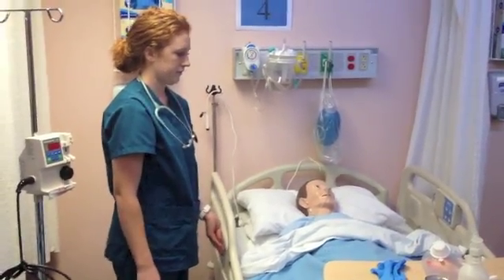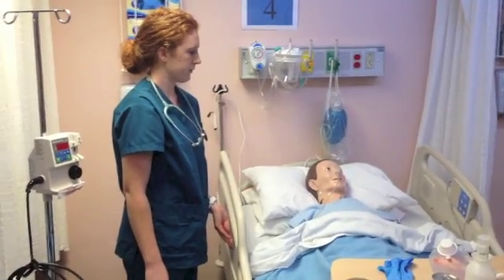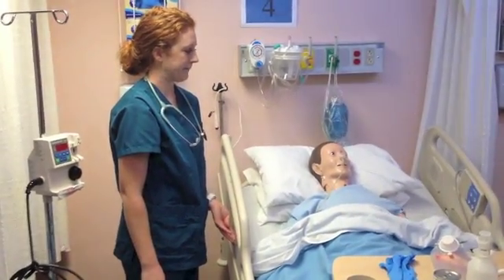She's going to then bring the bed up to a comfortable working level. She's also going to raise the patient's head of bed because for this procedure, it's going to need to be at a 30 to 45 degree angle.